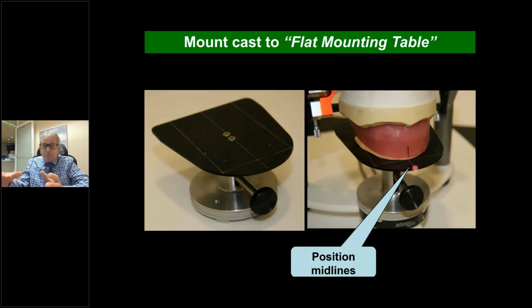Even better, if you turn the patient sideways in the chair, you're sitting in your chair and you're knee to knee with the patient. It's so easy just to go whoop, and mark it that way also. So whichever way you want to do that is fine. But it's nice to have that initial line there, and it's not your midline unless you tell us that's where it was. Majority of the time, it's going to go down that median raphe into the center. So I'm still also doing that so it saves you time.